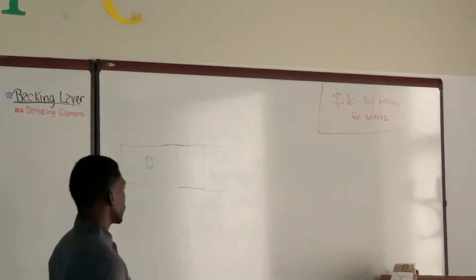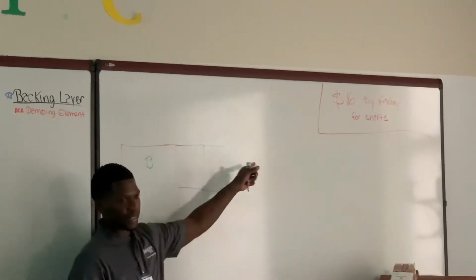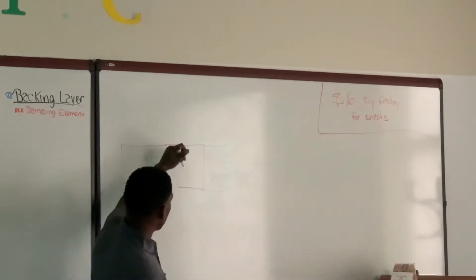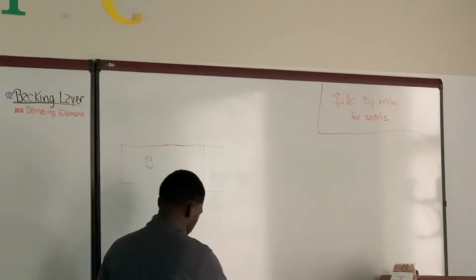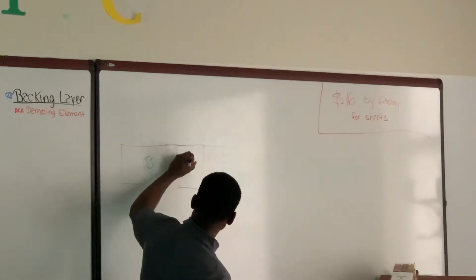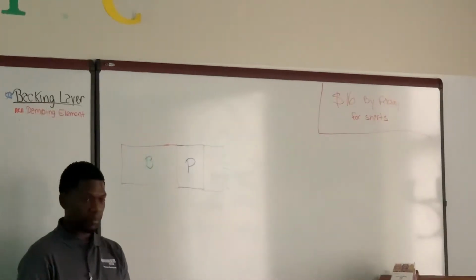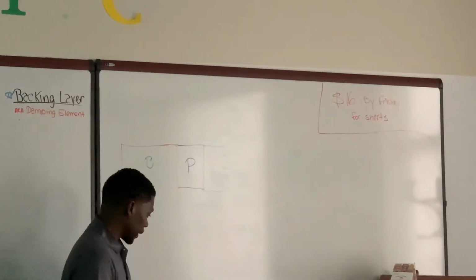So, backing behind the transducer, this is our transducer face, right? This is where my sound waves are coming from. Then we have the actual PZT itself, or our active element, which is in between the matching layer and the backing layer.